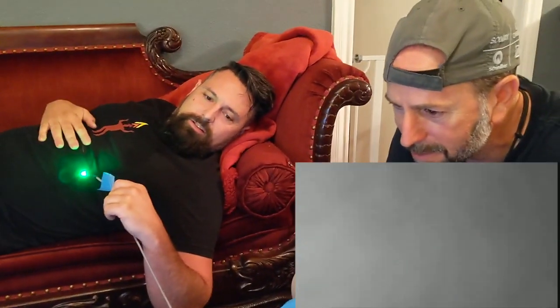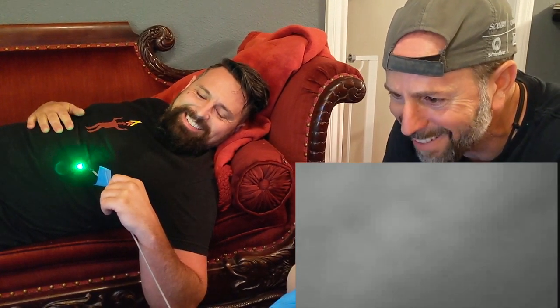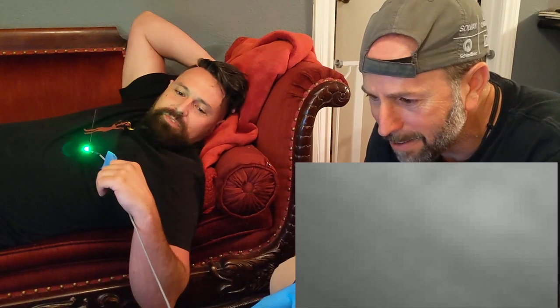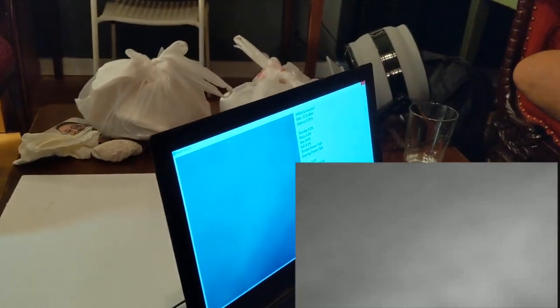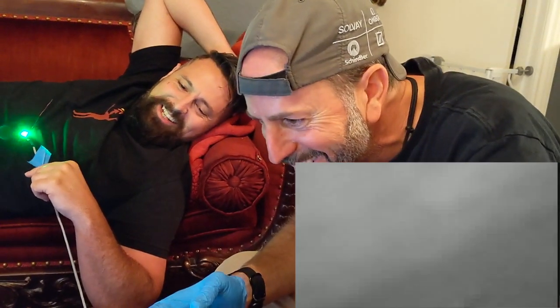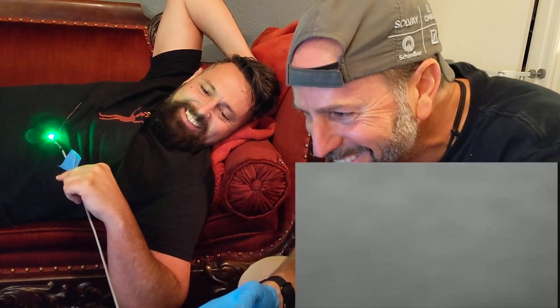First movement. I got movement — I'm moving inside Tori. I don't feel any discomfort. I'm moving. Feel a little closer — we're at negative 60 dBs on the radio. I can see some features inside. What the hell is that? I'm videoing you guys. We've got this thing recording its features.